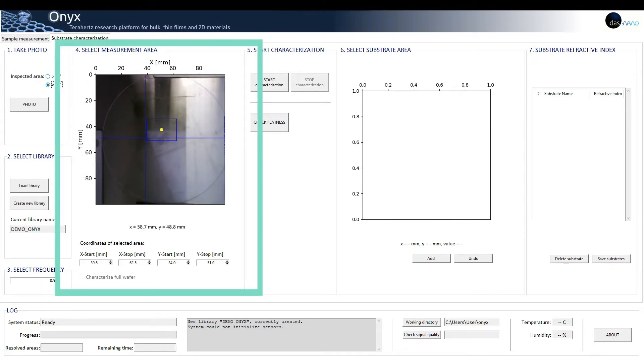Four: select measurement area. Once the system has taken a photo of the sample, the user can select the area of interest to be characterized.